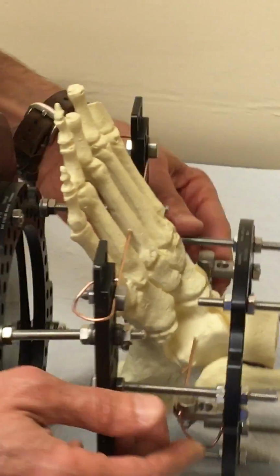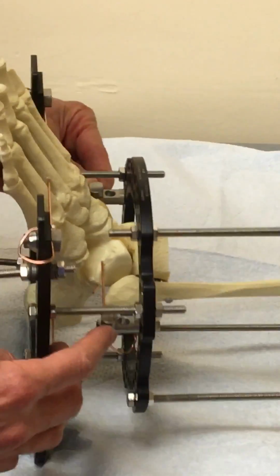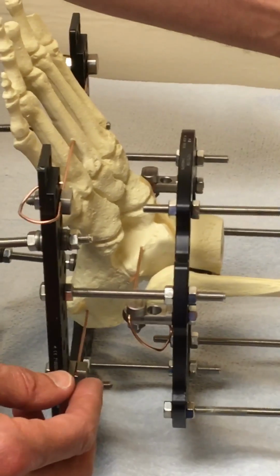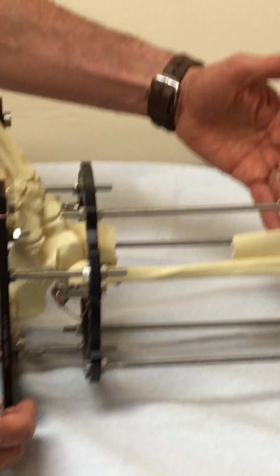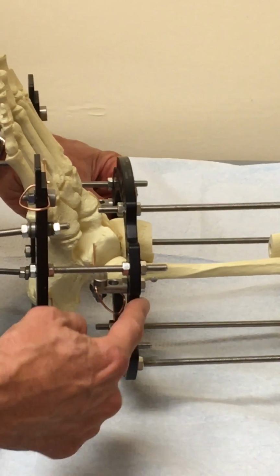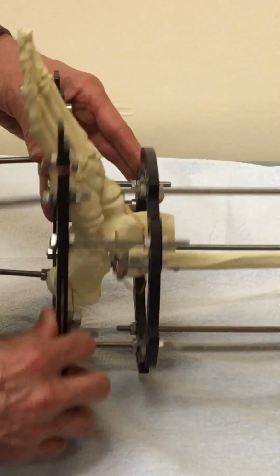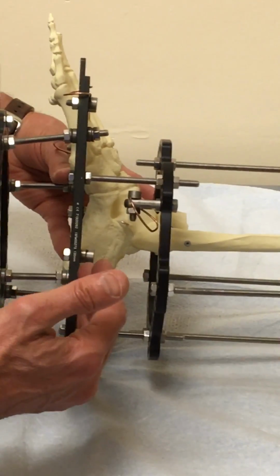Now, your patient has too little distal tibia to put a wire. So what we want to do, we want to put 1 wire in the talus like we've got here, and then you want to hook up the frame so that you have good spacing for the bone transport. And that may be that this wire in the talus gets hooked directly to the ring, or maybe like a drop wire like we've got here. And what will determine it is the size of his foot and how this actually fits on his foot.